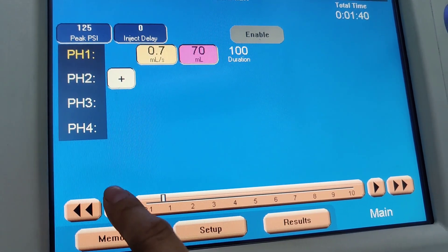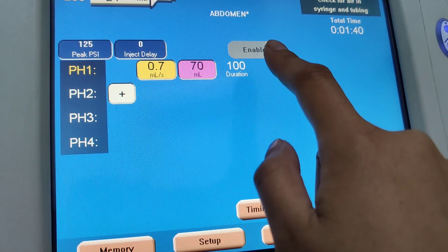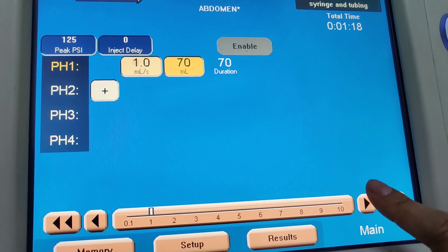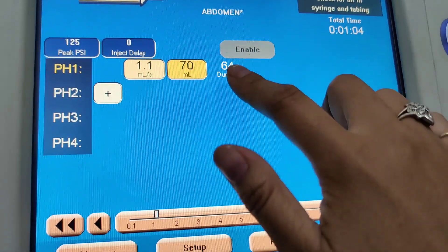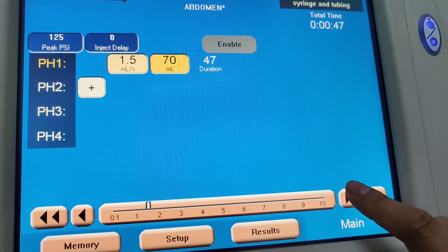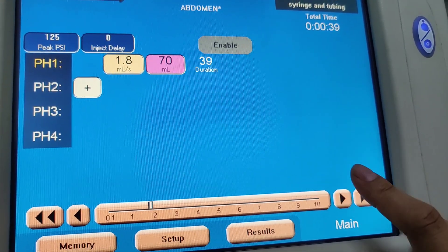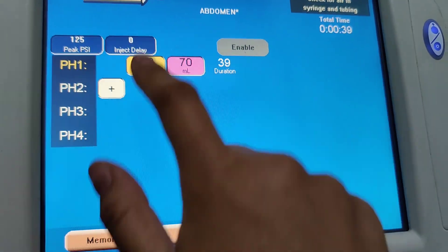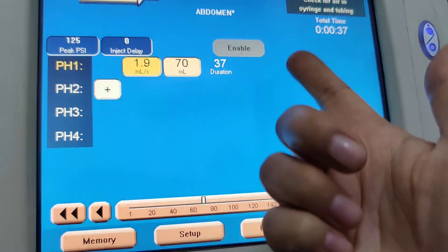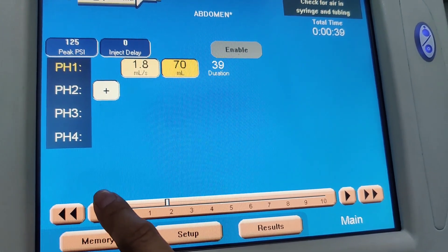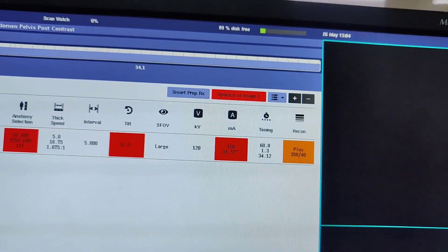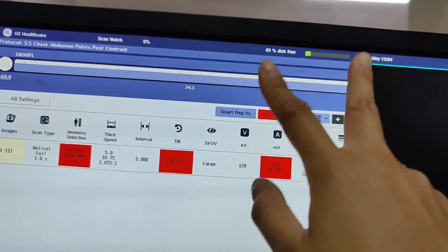If we go slow, that takes longer. But if you go faster — like pouring water into a bucket faster — that moves the duration toward the number we want, which is around 40. Increasing the flow rate brings it down: 47, 44, 41, 39. I can leave it around 37 to 40 — that's fine. Any of these values work because the contrast will finish before the scan starts, and contrast will be where it needs to be with about 20 seconds to spare when scanning begins.